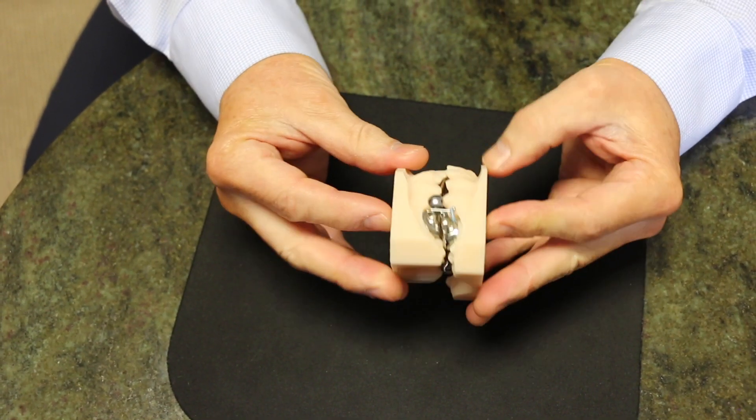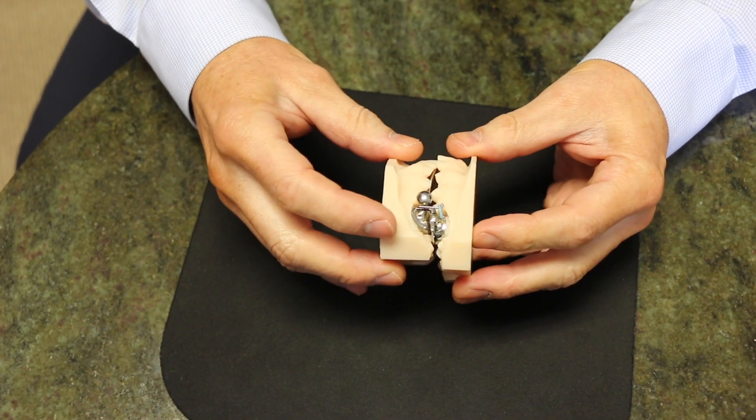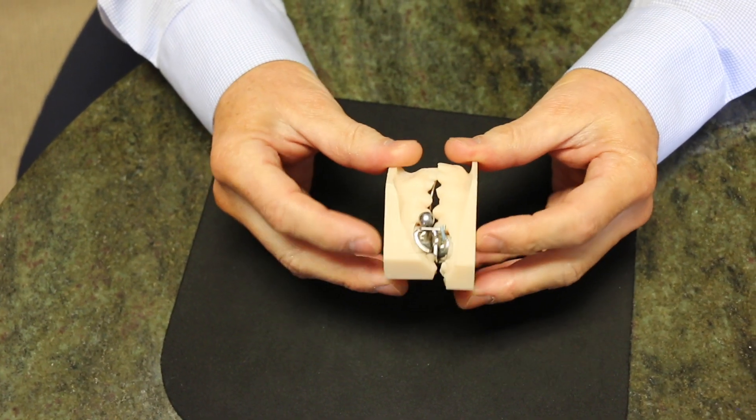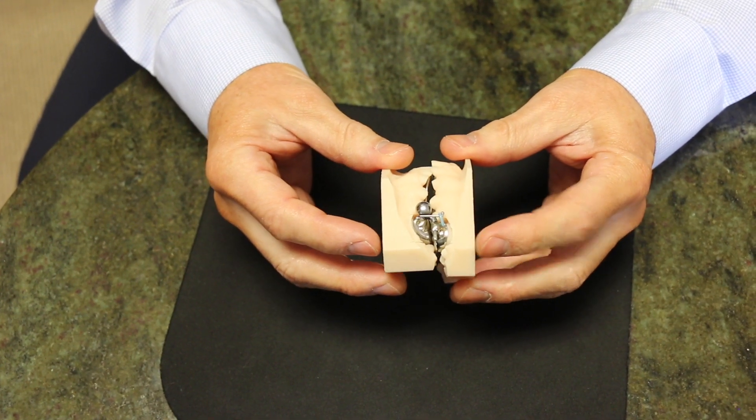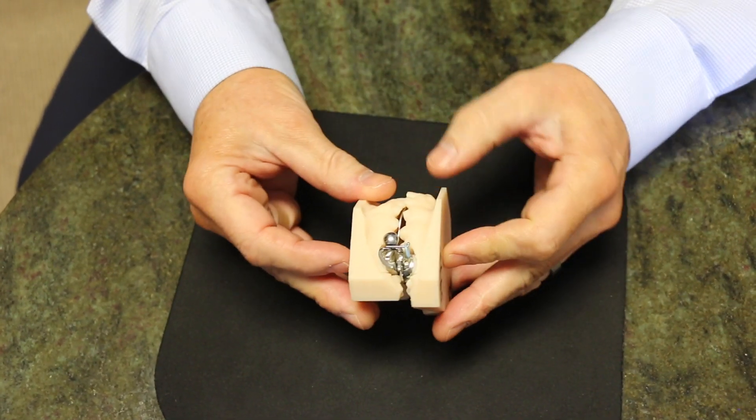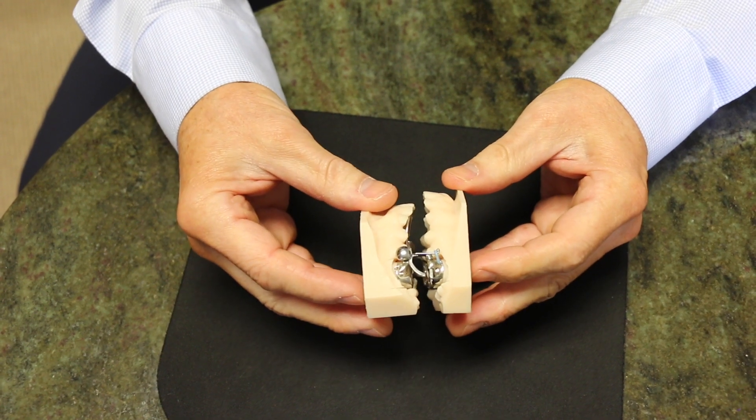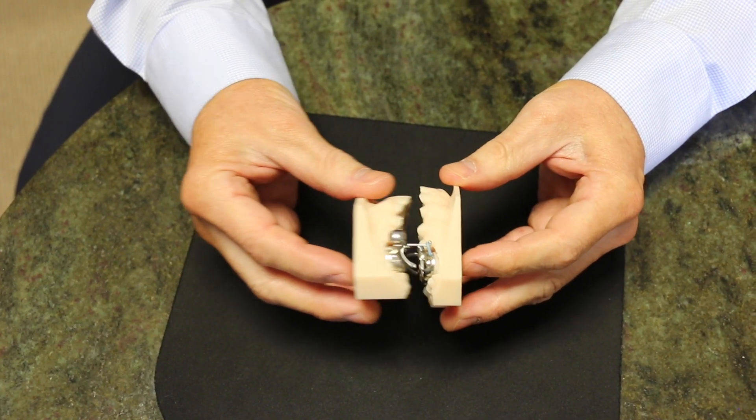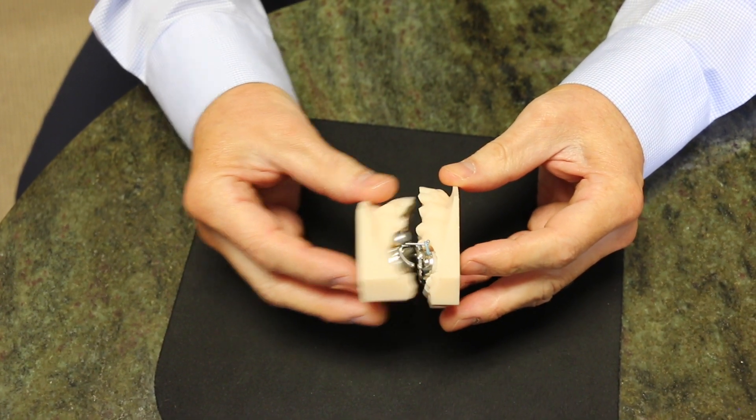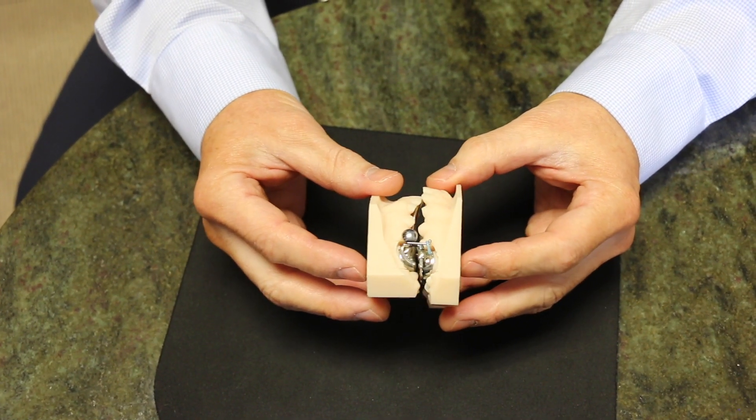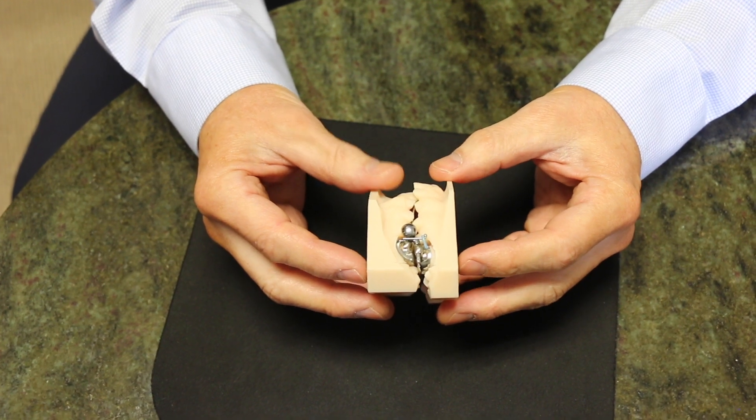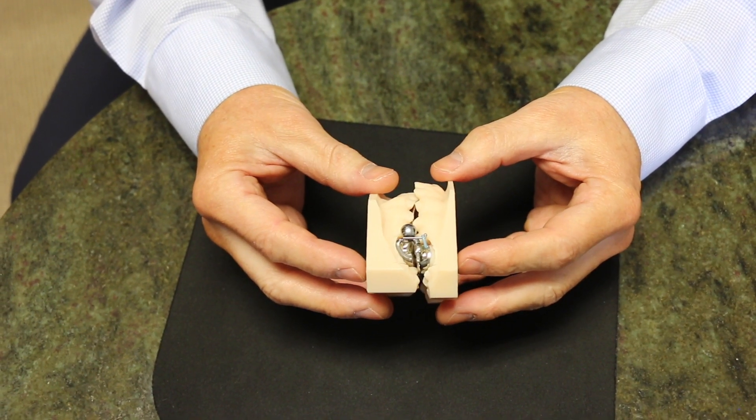Now of course that is not permanent because if I just took this thing off the next week the bite would go back to where it started. So what we have to do is when patients are growing we move the lower jaw forward like this and the patient can open and close, they can eat, it just takes a few days to get used to it, and we make them essentially move their jaw forward and leave it in that place for a year.